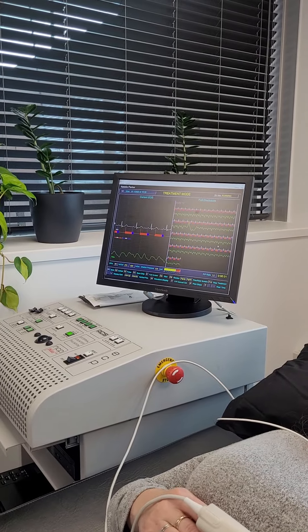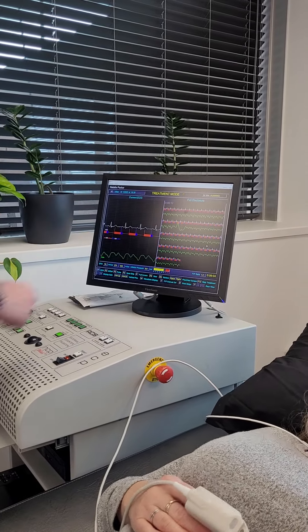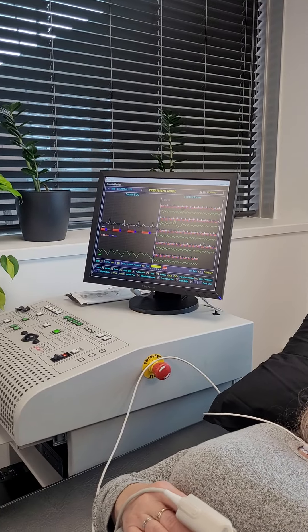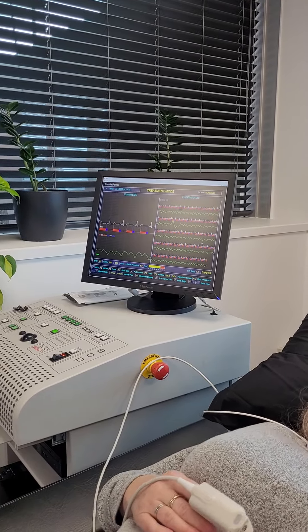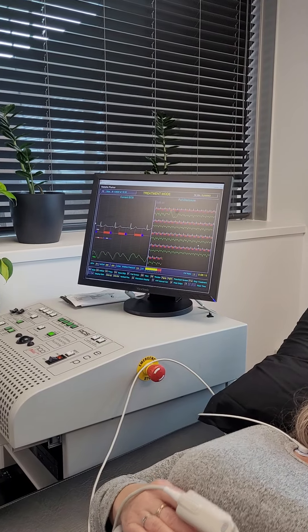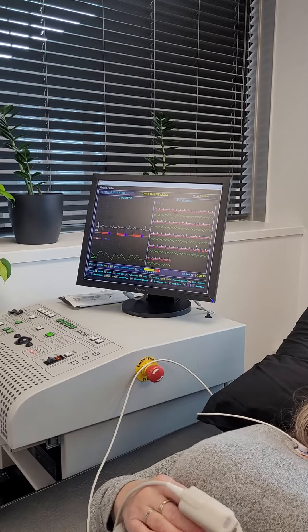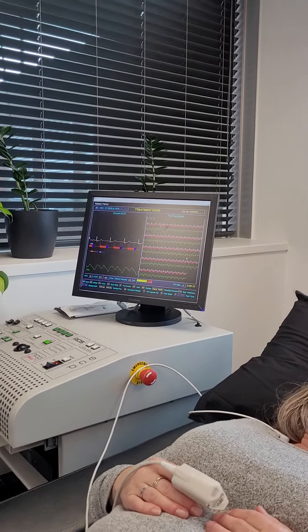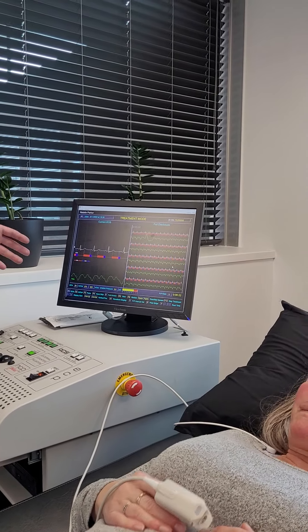Now it will automatically come up every 15 minutes. But you can do a breathing after, or you can even go back to the treatment once you've done and do a breathing then. So for instance, if you had another patient and you didn't have time to do the breathing — if something's going on, you just come back after the treatment.